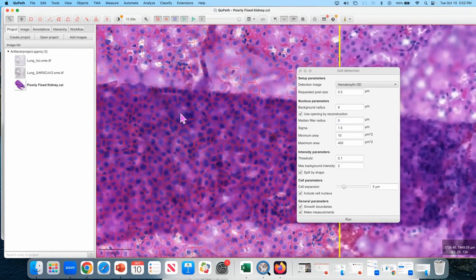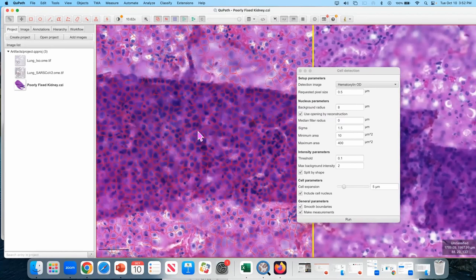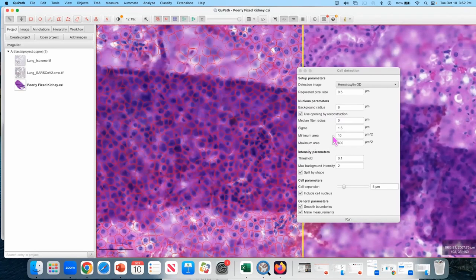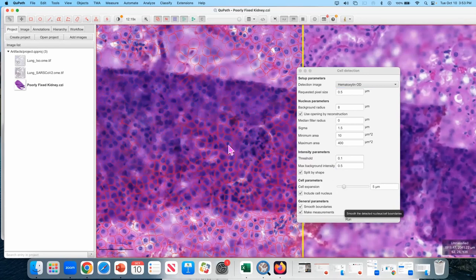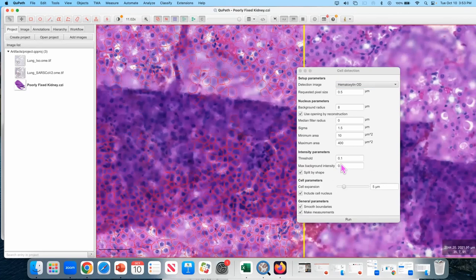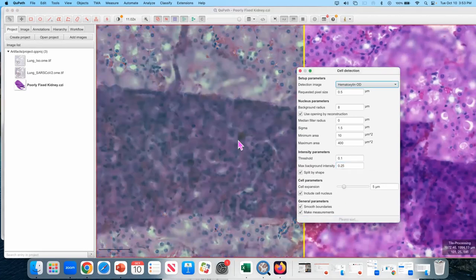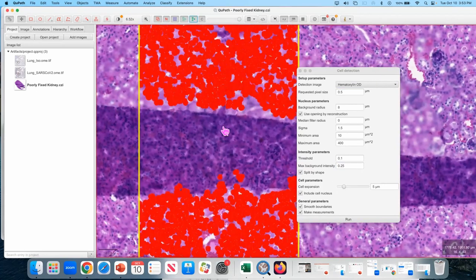So a couple of things that we could do to at least get rid of that very nasty fold, which does not provide much useful information, is to change the max background intensity and lower it. Let's see how it's going to deal with a max background intensity of 1. Not much change. 0.5. Looking quite a bit better. 0.25. And we largely eliminated that fold.